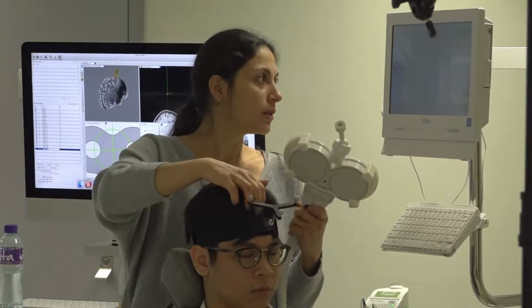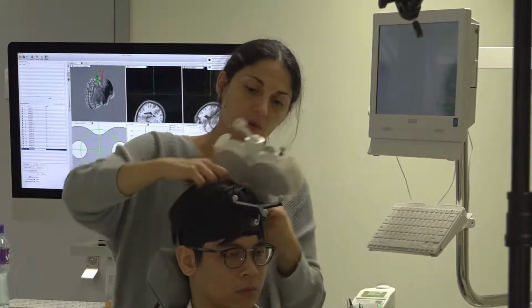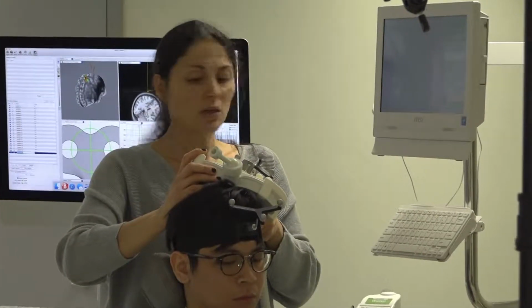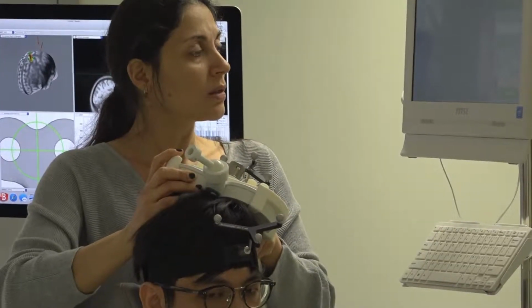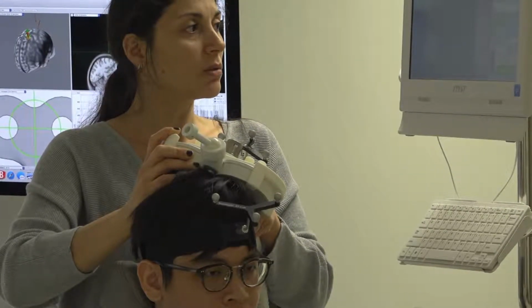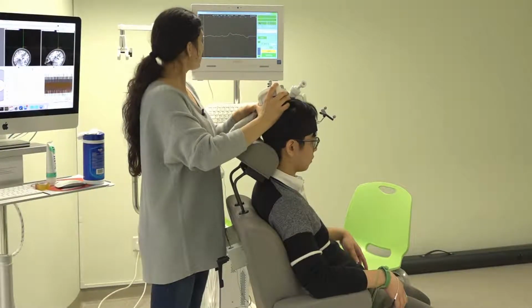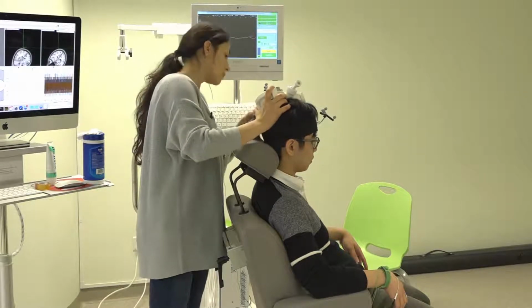Okay, let's see. It should be somewhere probably here. Let's try. It will not work because he needs more intensity. With 70 for sure we will be able to do it. 65. See? Are you fine?